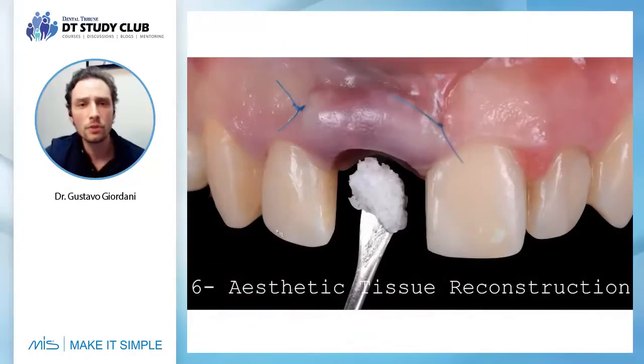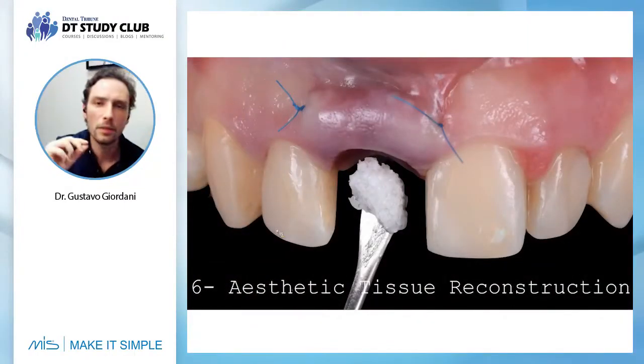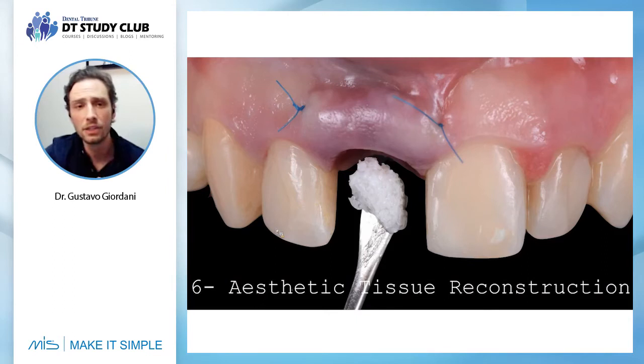So now it's time to move on to step number six, which is the aesthetic tissue reconstruction. This step is very important, and we need to do it in all of our cases.